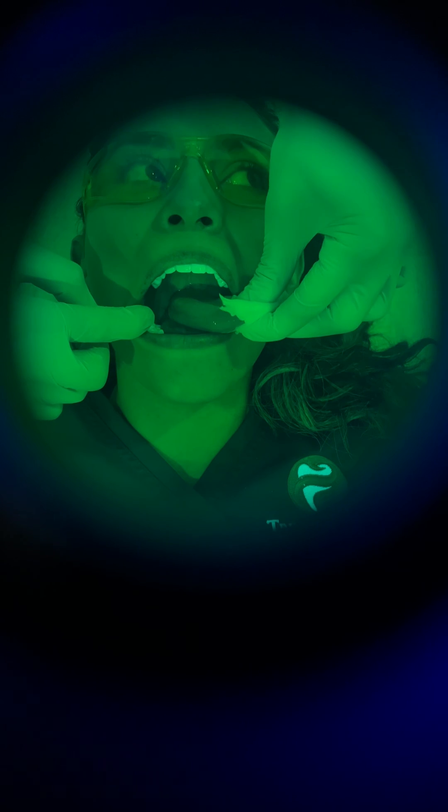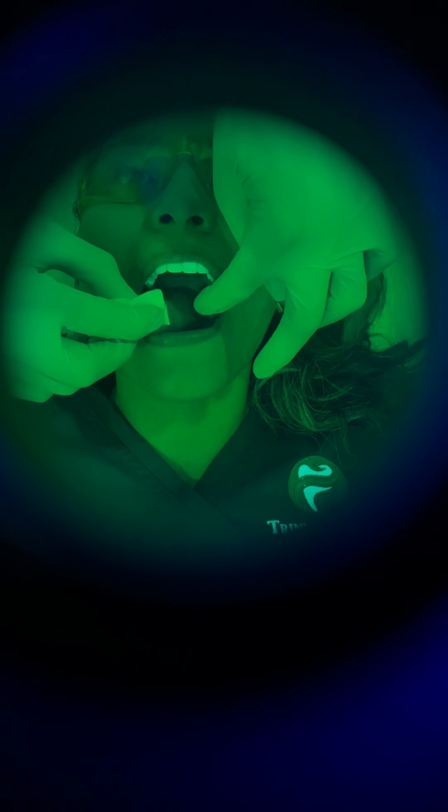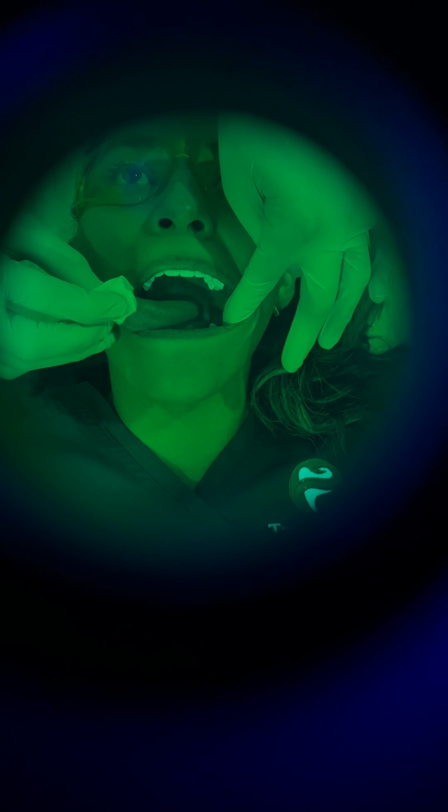Now we're going to ask the patient to stick out her tongue, and we're going to grab it with a two-by-two as we check the lateral borders. We check all this area right here for any abnormalities — everything looks clean. We're going to switch now to the other side. We make sure we see all the way to the back, because this area is usually the area that we have more cellular changes. Everything looks clear right there, too.